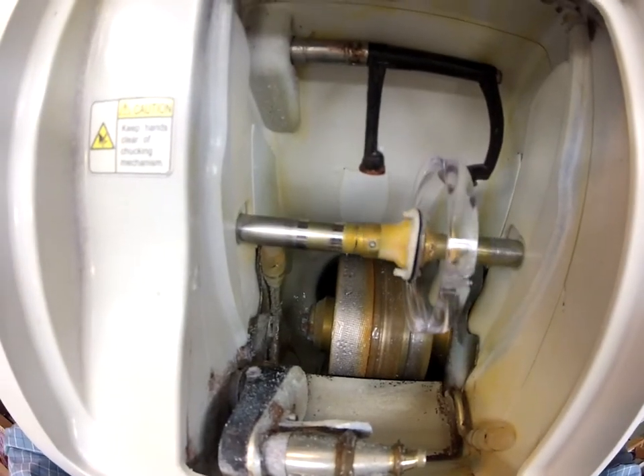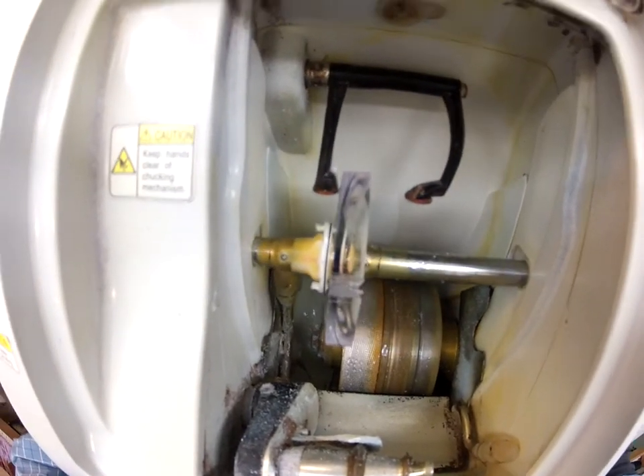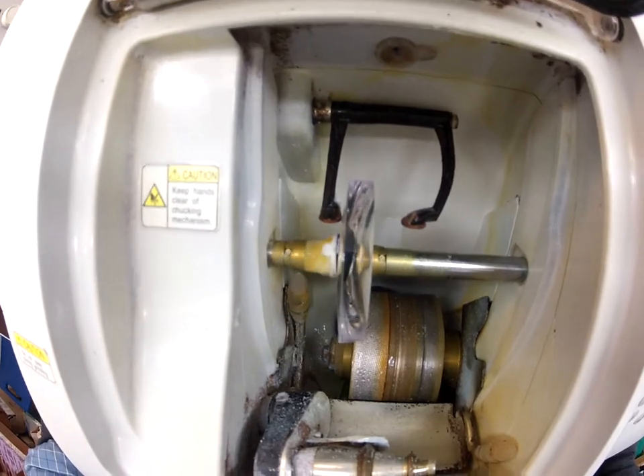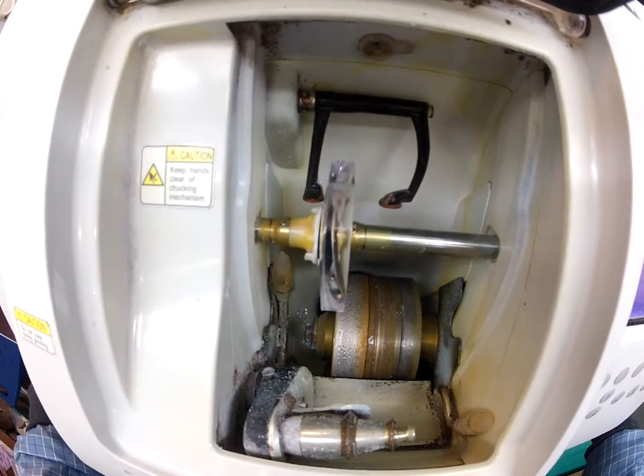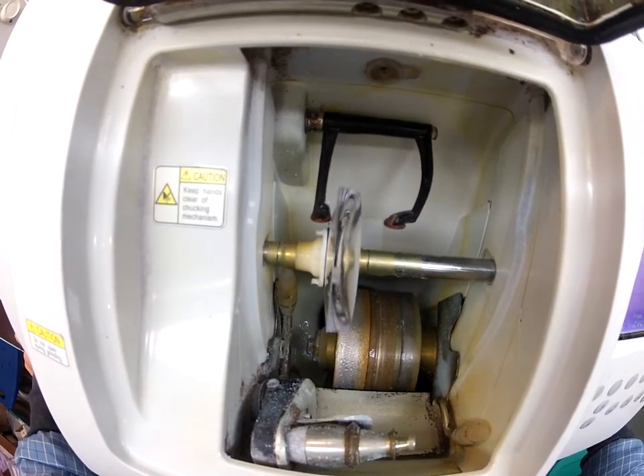The actual cutting wheel is down here on the left. There's three wheels total. The cutting wheel is going to grind away most of the polycarbonate. This wheel in the center that has that little channel is what's going to put the bevel onto the lens so that it stays inside the frame.